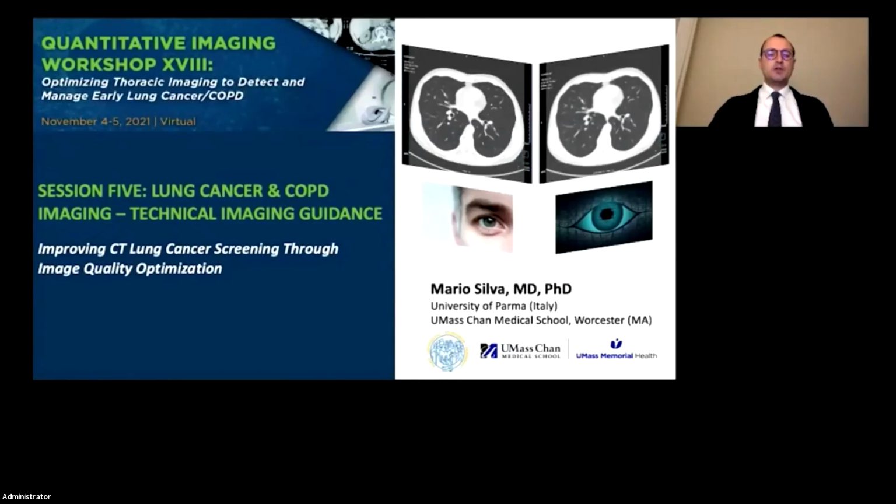And indeed, low-dose CT with visual reading standards is also needed for confirmation of the lung CAD marks and for reviewing other features such as interstitial lung abnormalities and further small findings such as bronchial thickening or emphysema or other parenchymal details.